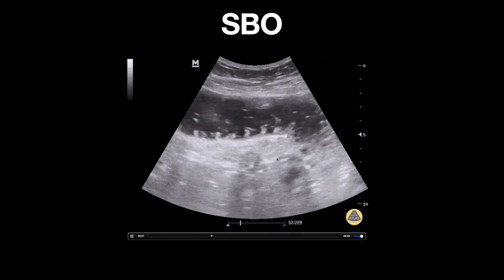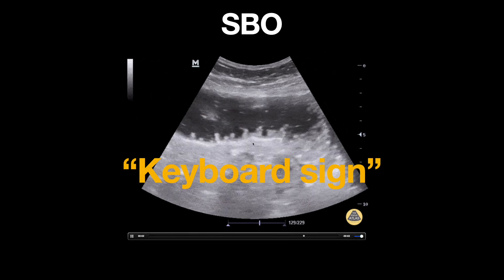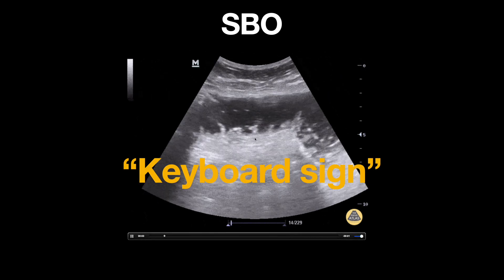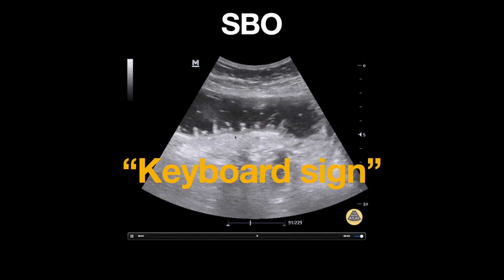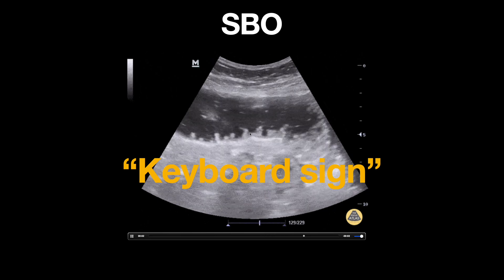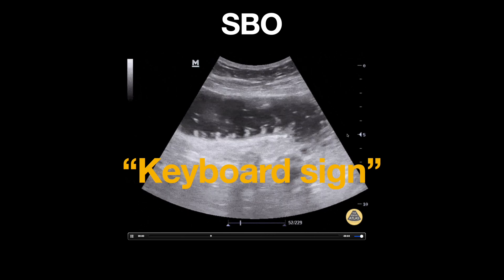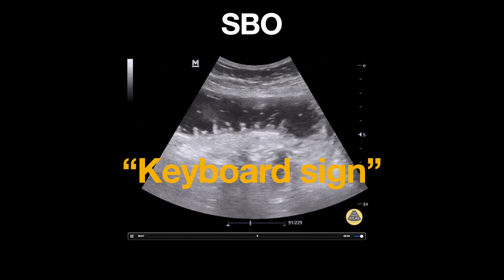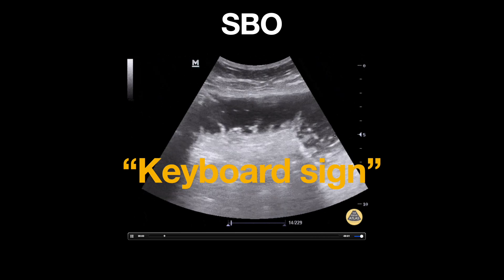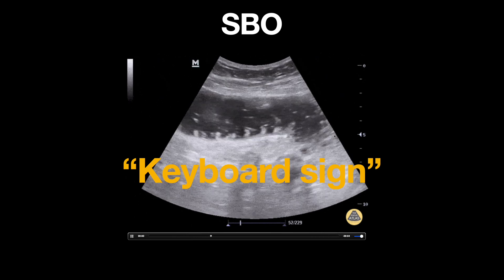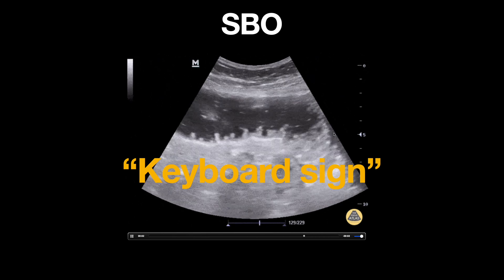Lastly, we can see the keyboard sign. Notice these finger-like projections along the wall of the small bowel — these represent plica circularis. Normally these are not seen; however, when the bowel becomes fluid-filled due to obstruction, they become more visible.